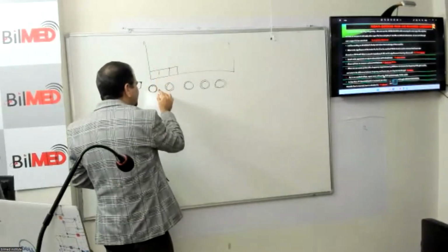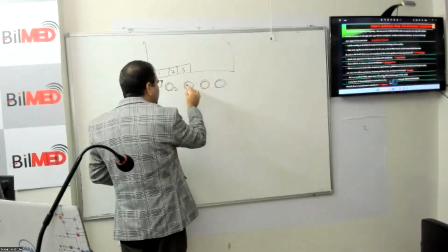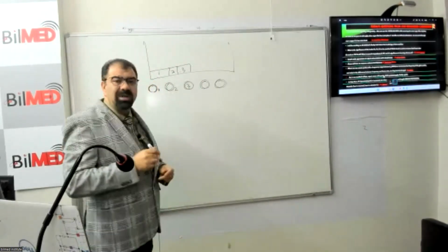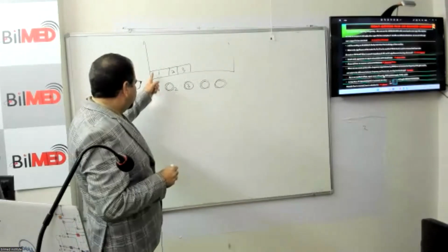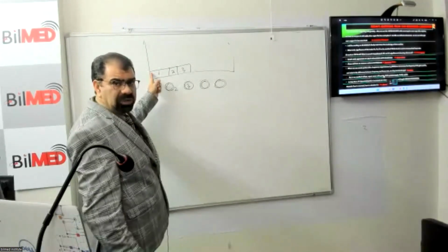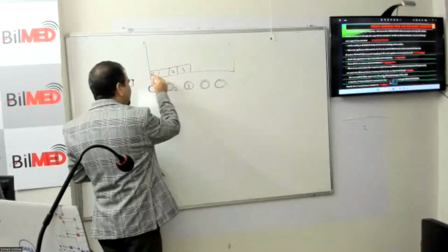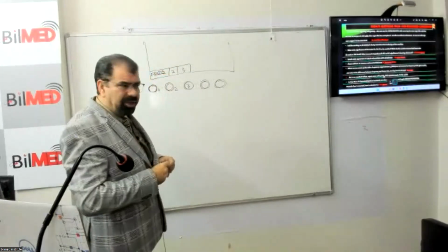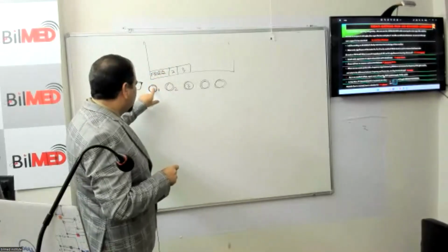This is the first display, and this is for the first knob. This is the second box, which is for the second. And the third will be for the third knob. So whatever is in the first box on the monitor, that is the function of this knob for this particular point of time. So you have to see on the monitor, and the monitor will show you frequency over here. Now see the point, if the monitor is showing that the frequency is written over here, then only the first knob will be for the frequency.